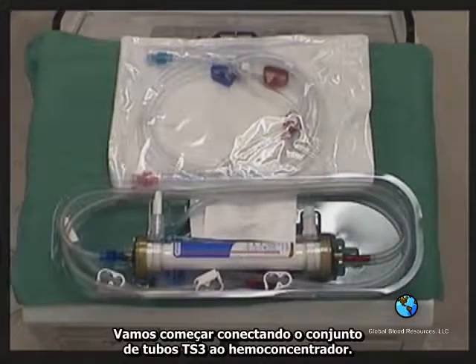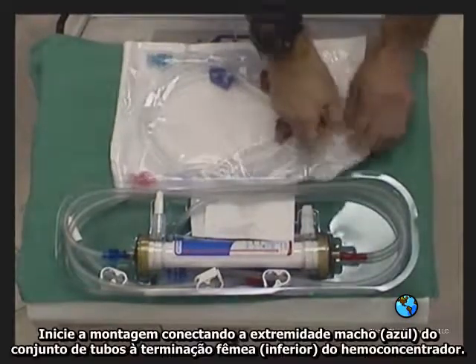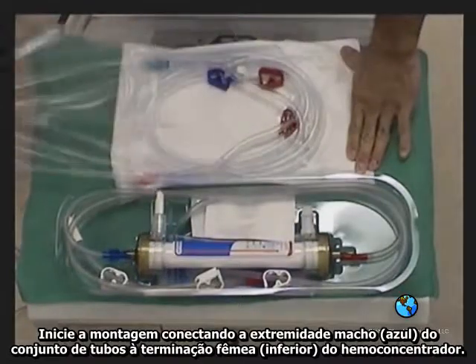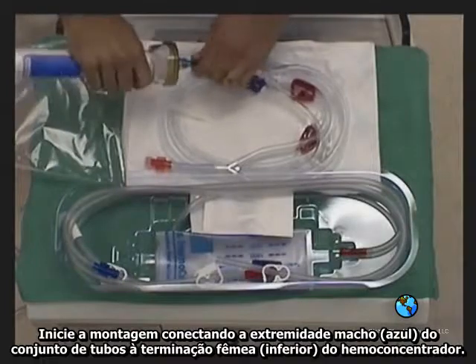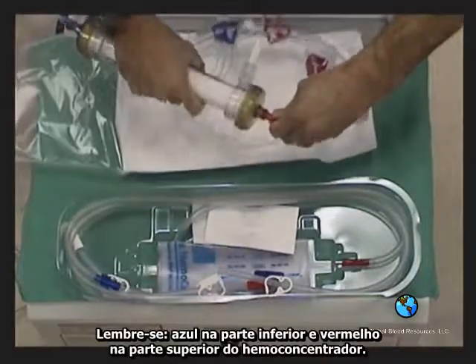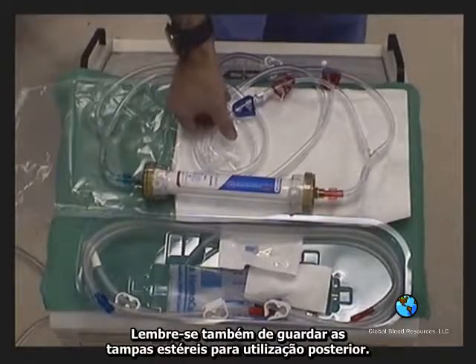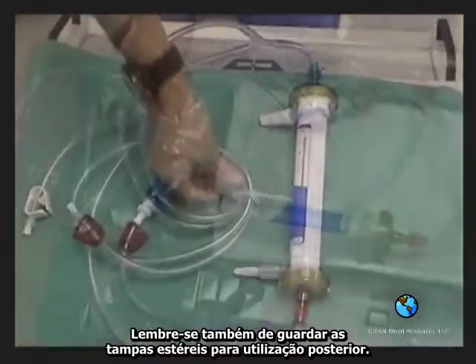Let's get started by attaching the TS3 tubing set to the hemoconcentrator with luer end caps. Slowly peel back the sterile peel pouch, exposing the TS3 tubing set. Attaching the tubing set is easy by screwing on the male luer of the tubing set to the female luer end cap of the hemoconcentrator. Remember, blue in the bottom and red out the top. Remember to save the 2 double male, double female dead end caps for later use.